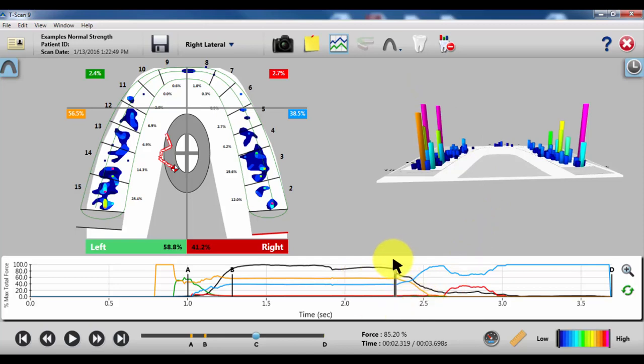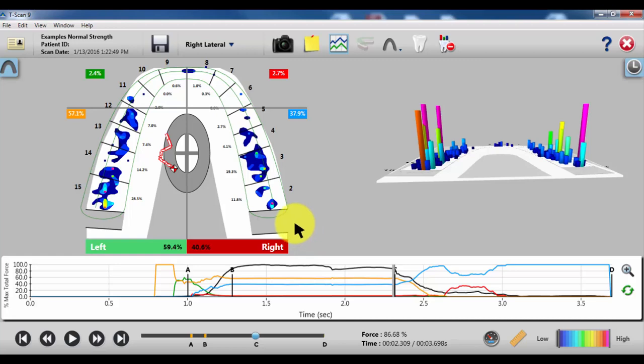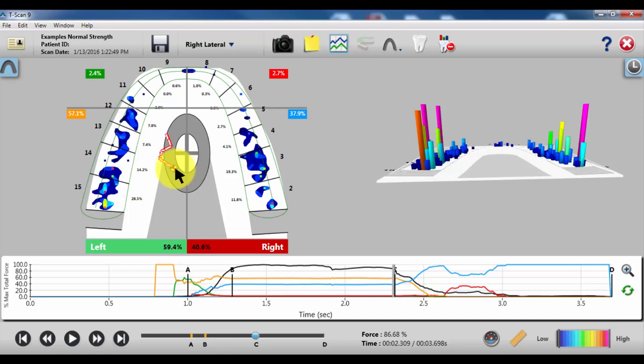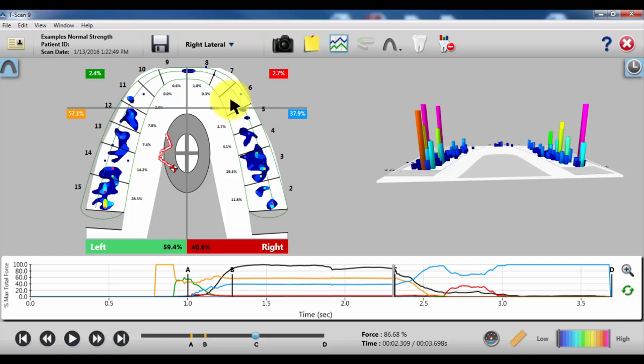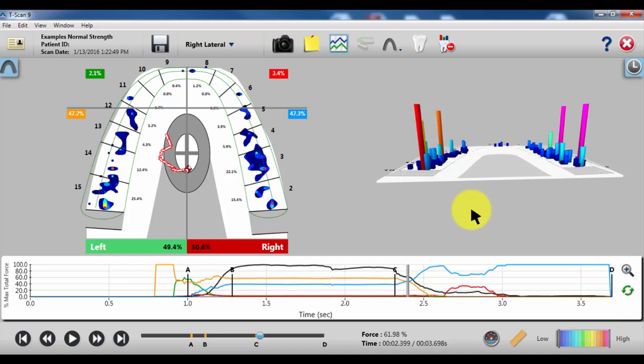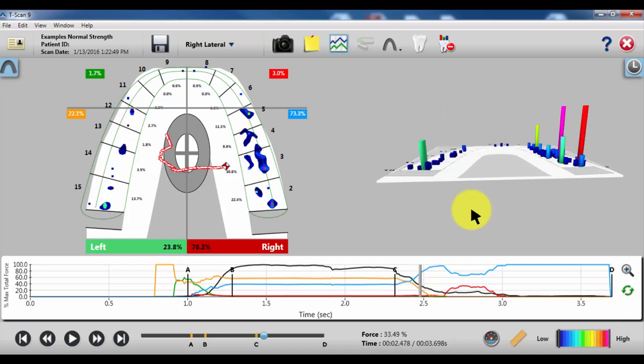When you start evaluating, you start from C and work your way through to D. What's a great helper for evaluating your excursions is the center of force icon. When this person starts to slide, we would like to see this icon do a nice, smooth, straight line to the anterior canine, number 6. But we get something much different. In this case, as I play the movie, it pulls horizontally right up onto number 3.